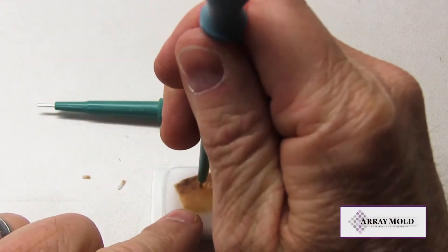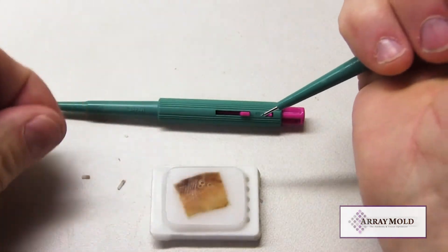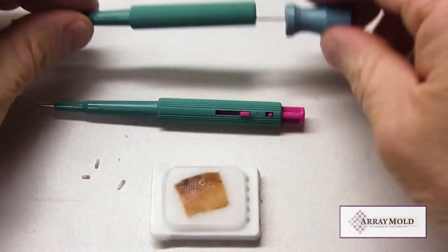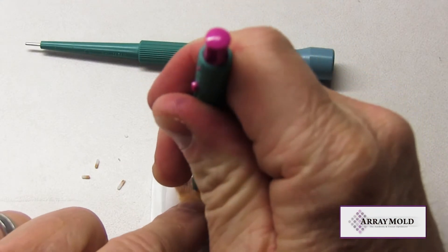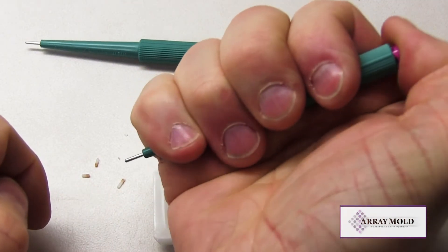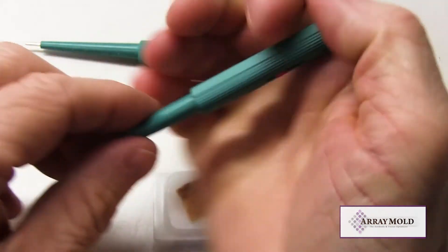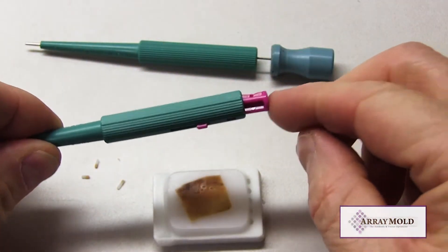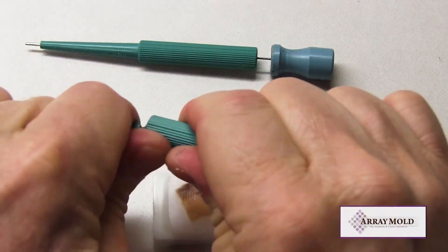As we continue to punch, the needle with the stylet will be consistent because of the stainless steel stylet. The plunger needle, on the other hand, with the internal plastic plunger rod, will collapse after several punches because it was not originally designed to work with formalin fixed paraffin embedded tissue samples for TMA construction.